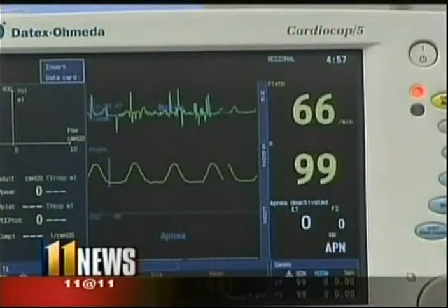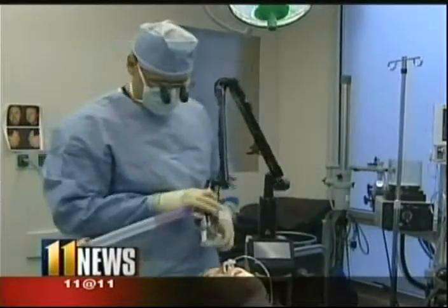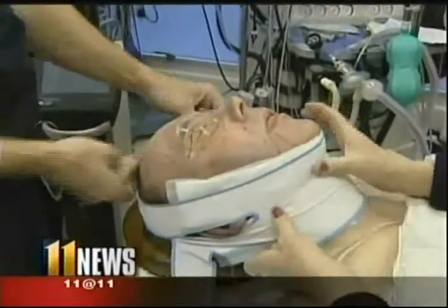Any surgery comes with risks. Laser on, fire in the hole. The finishing touches, a laser used to rejuvenate the skin. Reed is wrapped in dressings to hold everything in place for the next few days. By tonight, he'll be home. Don't get scared. It's not as bad as it looks.